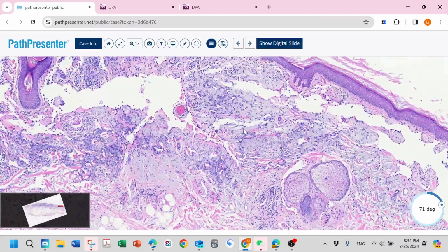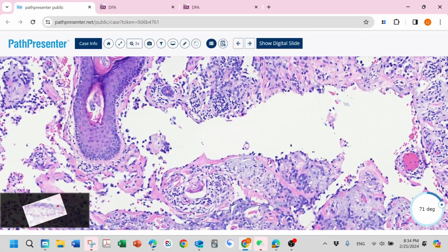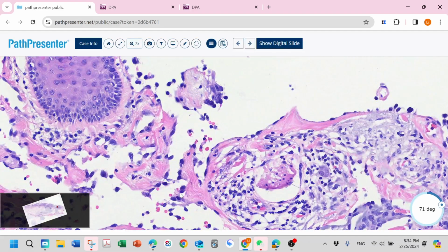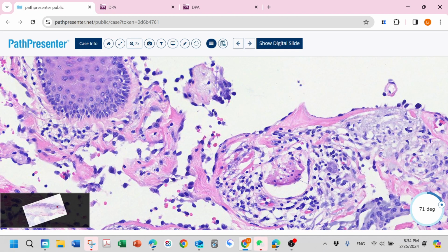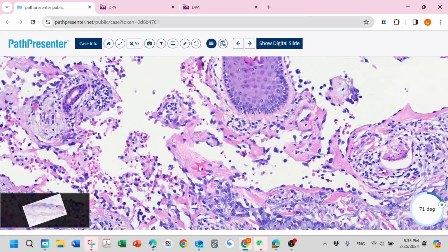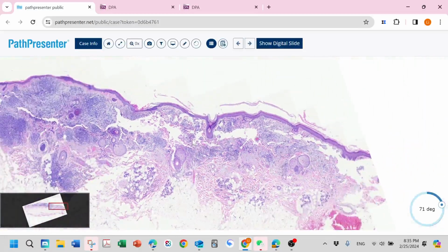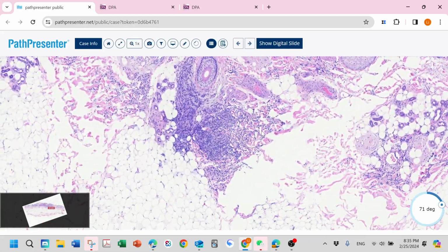Then we zoom in to see tons of these blood channels lined with endothelial cells, but these are not normal endothelial cells. Look, the nucleus is really dark, almost like a lymphocyte, but they are really big compared to the red blood cell. Really big cell, really scant cytoplasm, really high N/C ratio, really atypical-looking cell proliferation, really infiltrative, broad and deep, even going into the subcutaneous tissue.